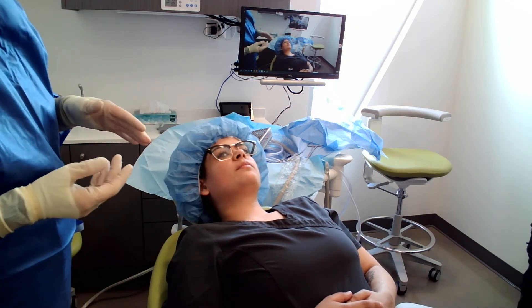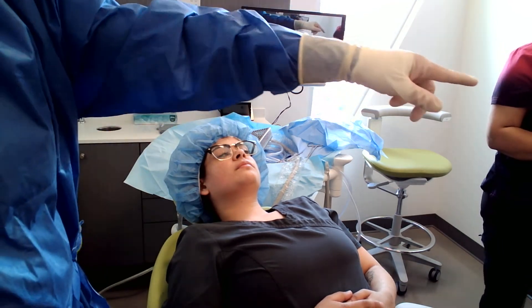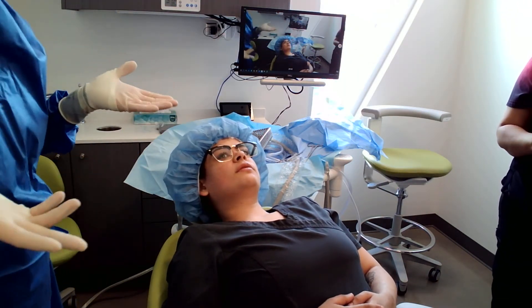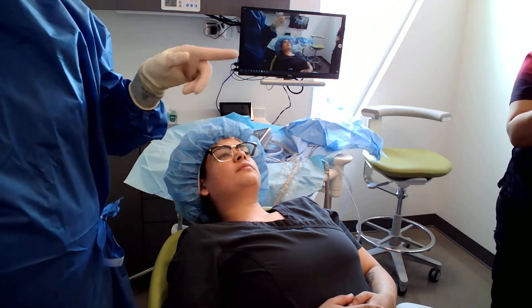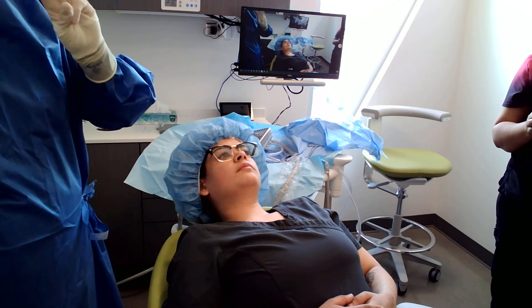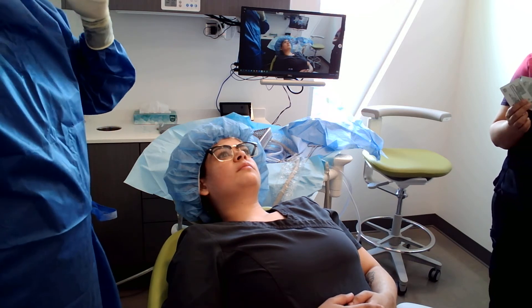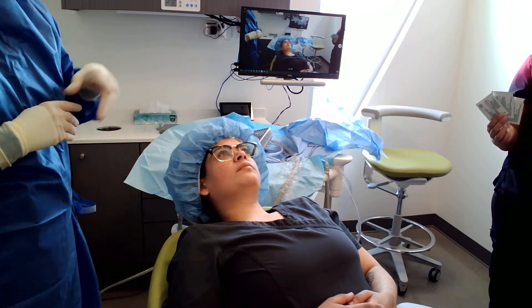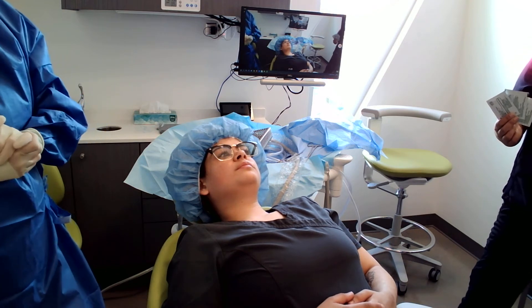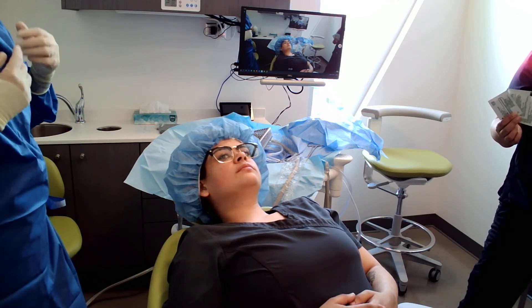Next we're going to prep our patient. Nina, with gloves on, is going to take one of those little prep packages — those 3M packages — and wash all the way around Courtney's mouth. That's chlorhexidine — you start at the mouth and work yourself out, and we do that three times, going even down the neck. If the patient is wearing safety glasses, we do the safety glasses too — we don't want to get that in the eyes. That's called soluprep — it's a skin prep, a lot nicer than alcohol, and it actually feels pretty good.